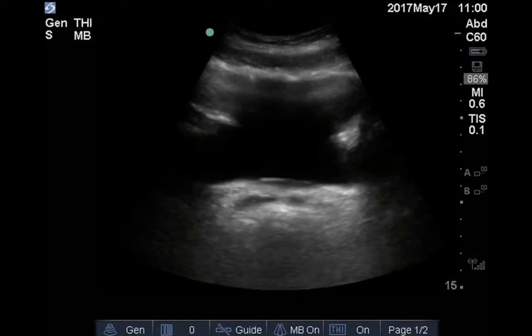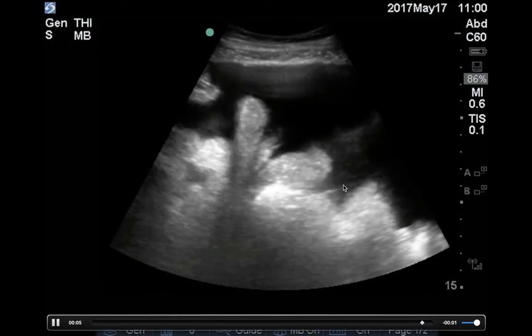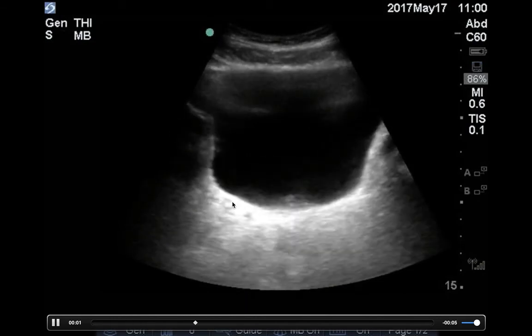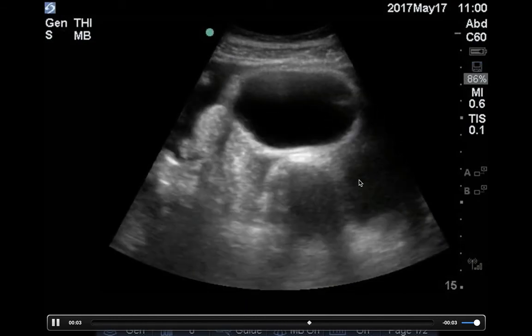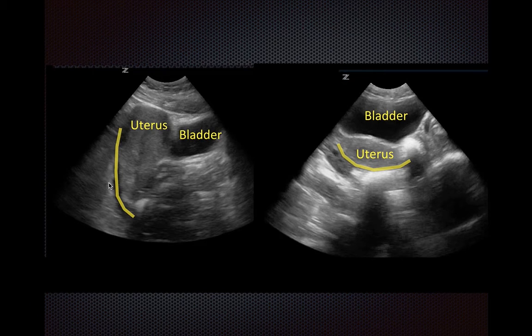Here's a positive pelvic scan where you can see the bladder with free fluid surrounding it. For a female patient, fluid tends not to accumulate just posterior to the bladder; instead it accumulates in the pouch of Douglas, which is the rectouterine recess. You've got the uterus here and bowel behind it — that's where fluid accumulates in the longitudinal view, while in the transverse view fluid tends to accumulate behind the uterus.